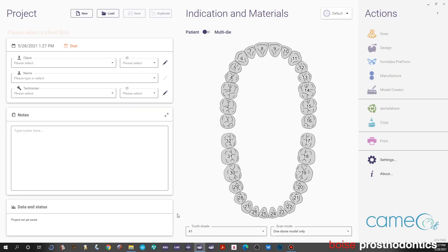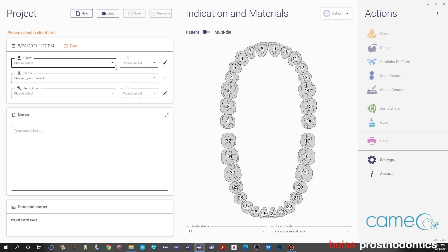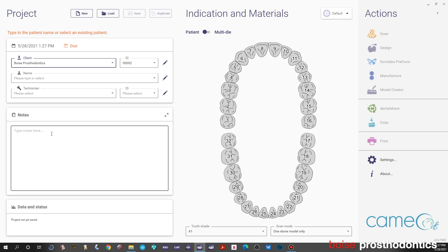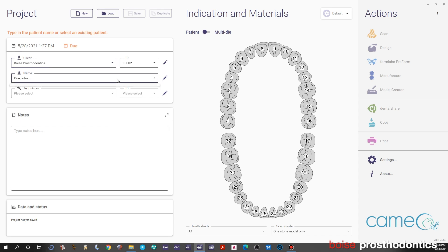Open the Galway and start a new project. This shows the numbers of the teeth. You can select a client—in this case we're using Boise Prosthodontics—and type in a name. In this example we're going to use John Doe as our patient name.